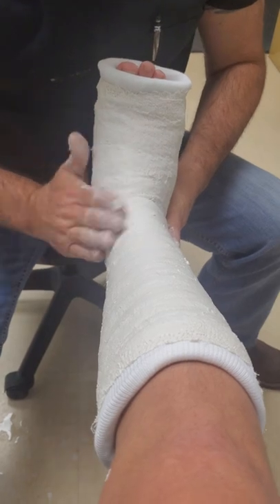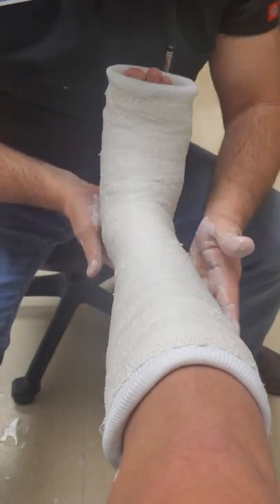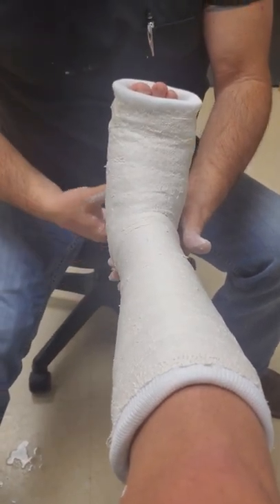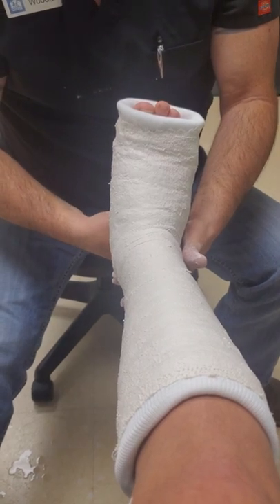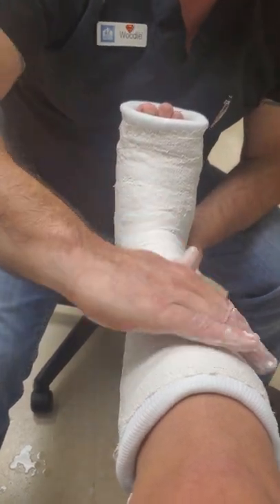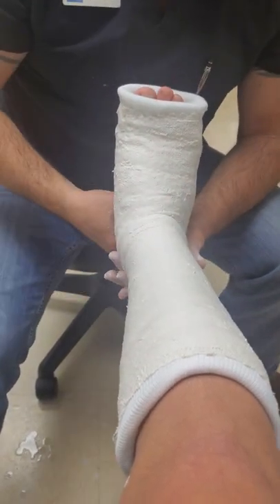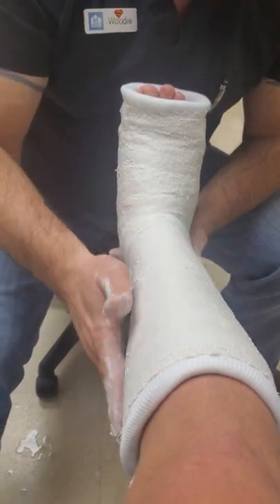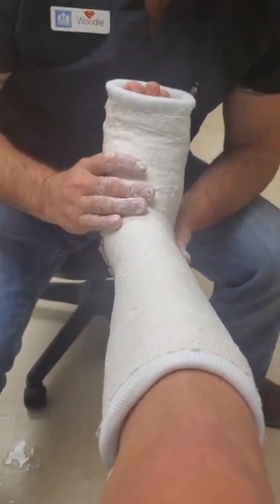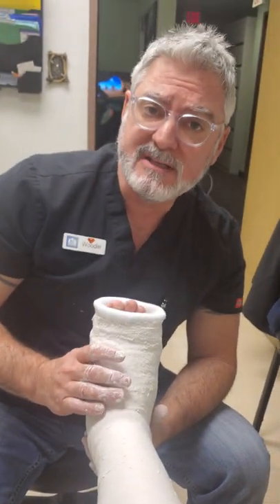You can see it's starting to take that appearance we all remember as kids back in grade school days. I hope this is what you expected when you asked for the plaster short leg cast. One thing real quick — you'll remember back in the old days they used to put a little heel plunger for weight bearing. I've noticed more nowadays whenever I see a plaster short leg weight-bearing cast they pretty much still use the cast shoes; every now and then I'll see a plunger down there, but I don't see those as often anymore. I hope this is a good video for you guys. Have a good day everybody, and if you think of anything else please leave it in the comments. Thank you very much for watching.